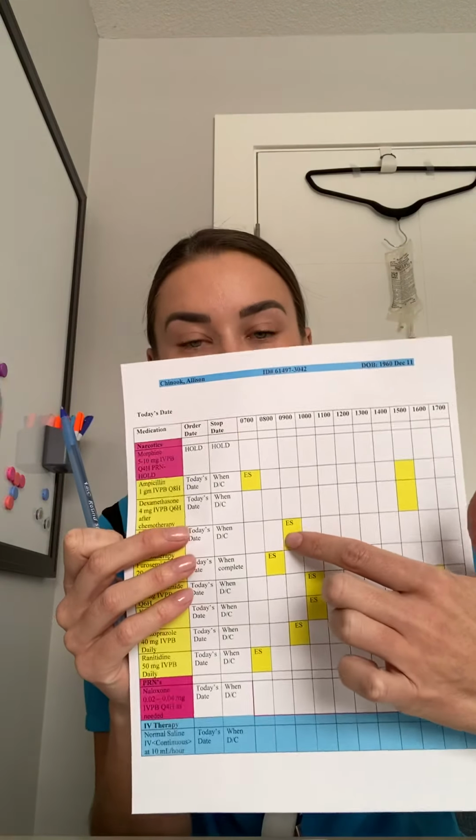And we just want to check on the doctor's orders here too to make sure that we're giving dexamethasone 4 milligrams IV piggyback every 6 hours after chemotherapy to start today on October 26, 2020. So that's perfect, we're matching there. It also says every 6 hours. Okay, so we just want to make sure that the dexamethasone hasn't been given within 6 hours. And here we are. We have dexamethasone 8 milligrams IV piggyback one time prior to chemotherapy, given at 900, and that's 6 hours, so we are safe to give our dose at 1500.